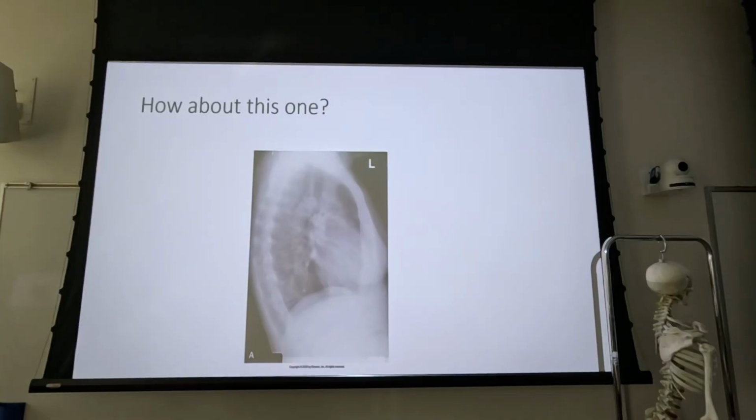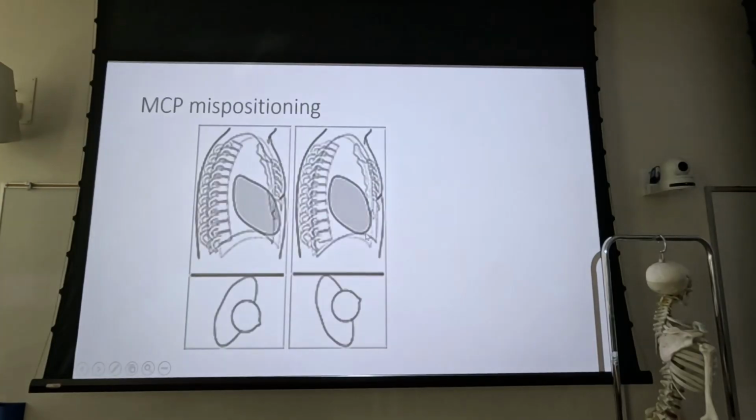Yeah, this one's just not really going to cooperate a whole lot. So we've got rotation, and we might have a little bit of mid-sagittal plane tilt as well. We don't have superimposition vertically. Where's the gastric bubble? Yeah, there. I don't know. The shadow of the heart looks like it extends beyond the sternum. So if we go back to that, then that would indicate, if this is true, that the left side is rotated more anterior.